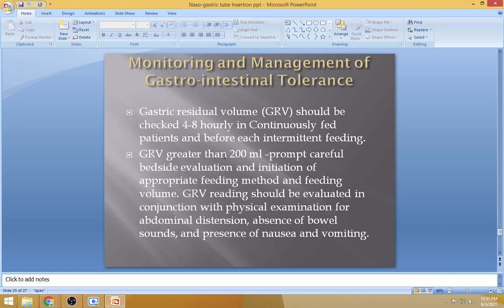When the patient complains of anything, you should not stop it immediately, but do a physical examination and find out. How will you assess the bowel sound? Through stethoscope. Yeah, through stethoscope. When you listen, there will be a typical sound that we know from the intestine. Or otherwise, we can ask the patient whether since the morning there has been any passage of gas, any fart. When there is bowel movement, even if they don't pass stool, the patient will pass gas. That means bowel movement is okay.